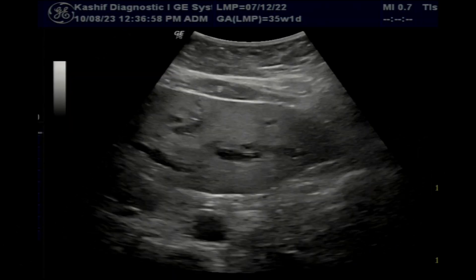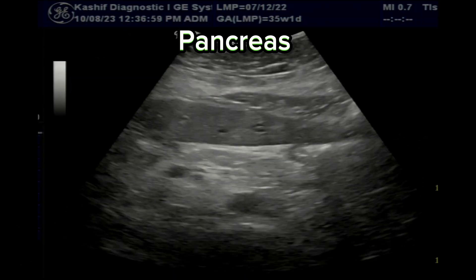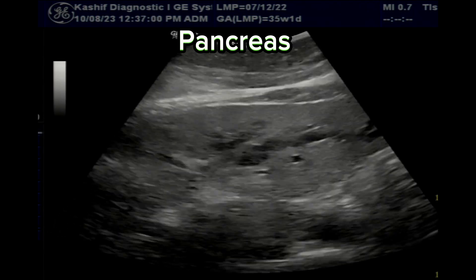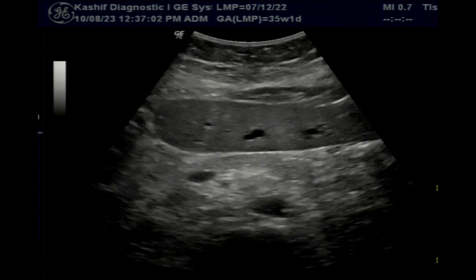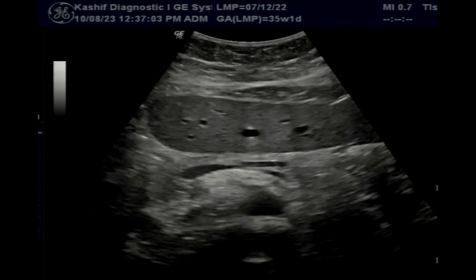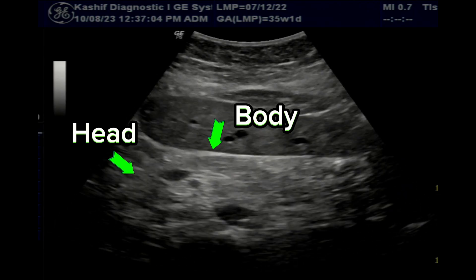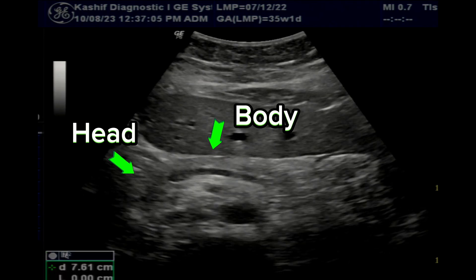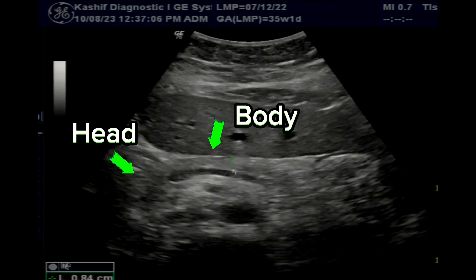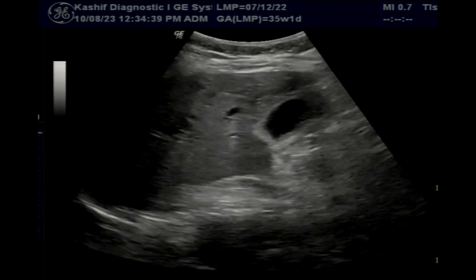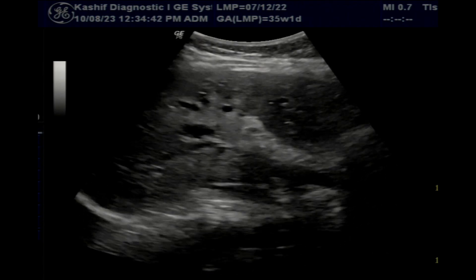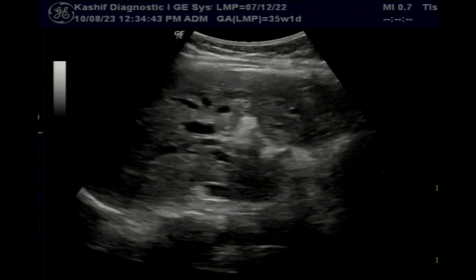The pancreas is visualized and is normal in size. No peripancreatic fluid or collection is seen. No mass or growth is seen in the pancreatic head or body. This makes it clear that the intrahepatic bile ducts are dilated but the CBD is not dilated.